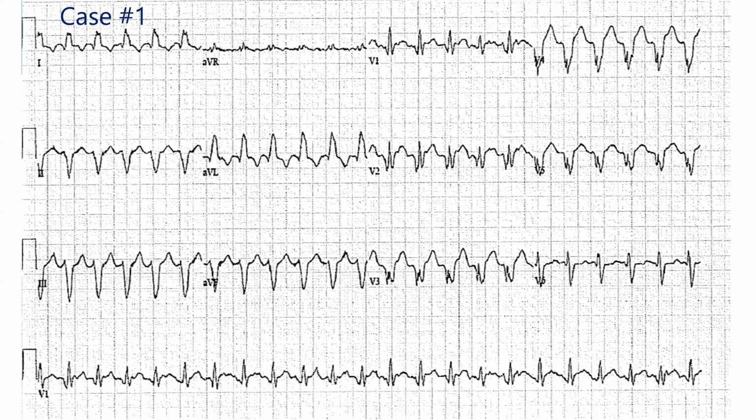And in this circumstance, here's this wide complex tachycardia at a rate of 140, and the vital signs associated with this tachycardia were exactly what I showed you earlier, in that you had an uncomfortable patient, mildly hypotensive, but not coming in in obvious shock. He's not coming in pulseless, etc. So always focus on what you're seeing, because remember, when you're thinking about how to treat tachycardias, you have not just options of medications to give, but also the option of a cardioversion.